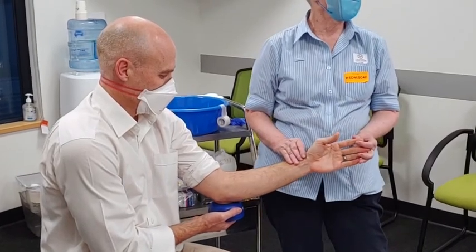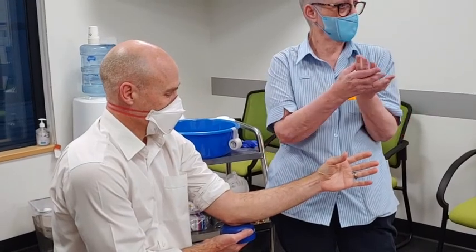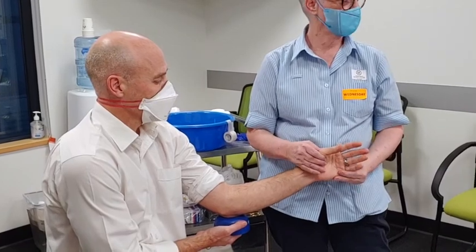Always make sure the arm's out and the fingers are straight, not curled over. You don't want the fingers crossed over or crunched up — it's not a good look inside the hands three weeks later.